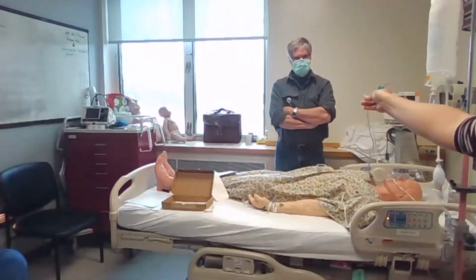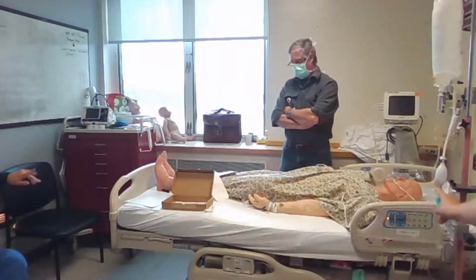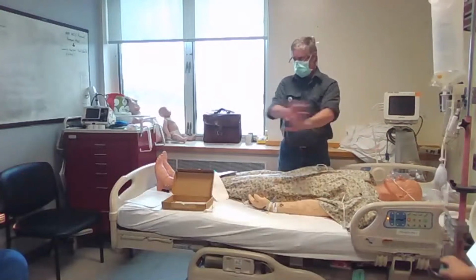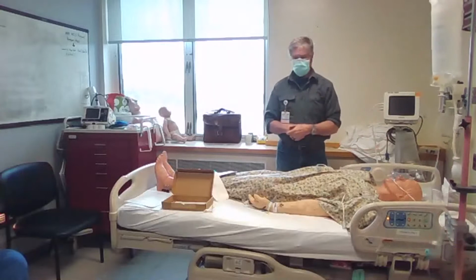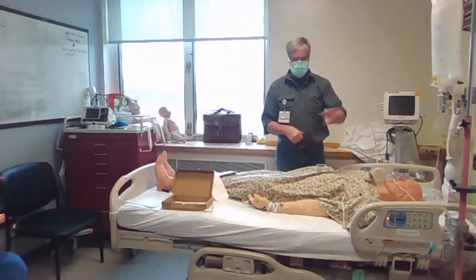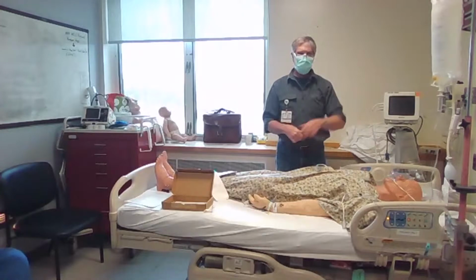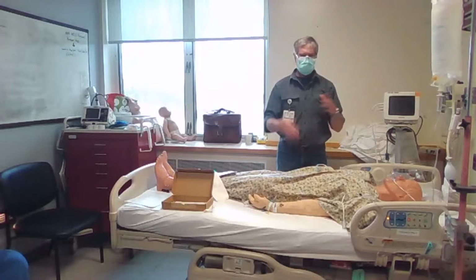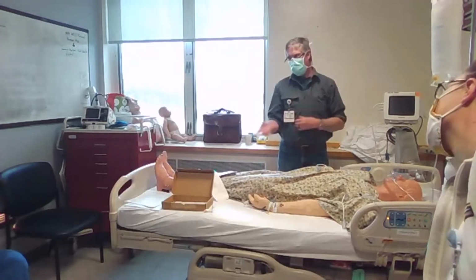So once you're primed, you're closing all of those stopcocks or just those two? No, you leave the stopcocks open from the bottom on out. Leave it open, okay. That's going to be the next part of what we're talking about, how to use it. So you close up there before you attach the patient. Well, that's your control of the reservoir. Is the easier way to put it. Anytime you want to turn your reservoir off, you can do that.